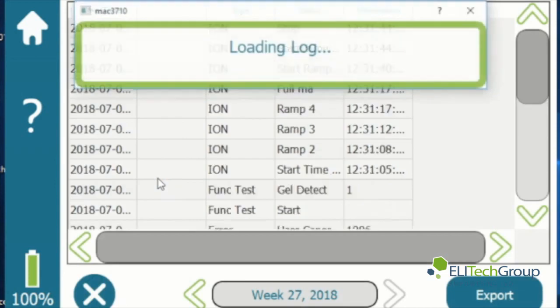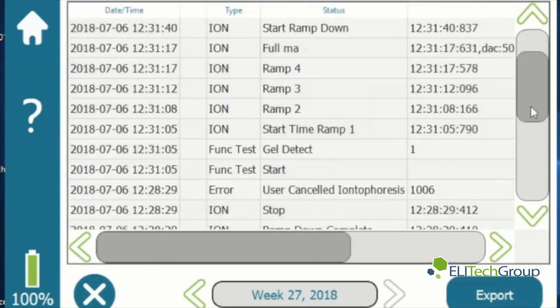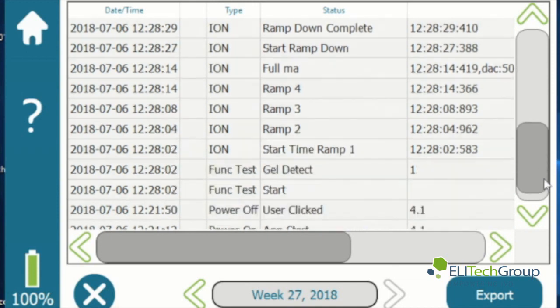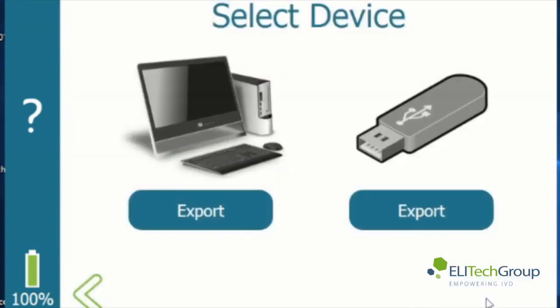Exit out of that screen and go to the system logs. This will show you all of the logs and all of the information that's been saved from all of the previous tests. Now if you press the export button it brings up your export screen, where you can export to a computer or export the data to a USB flash drive.